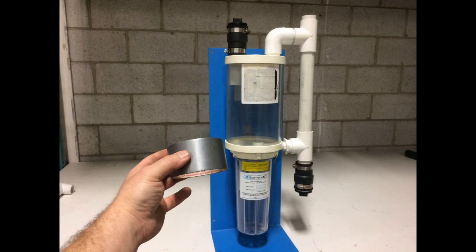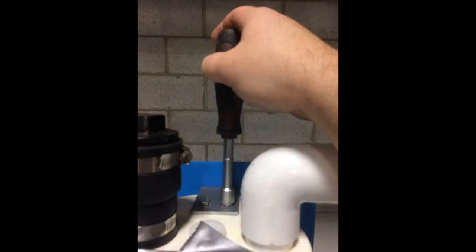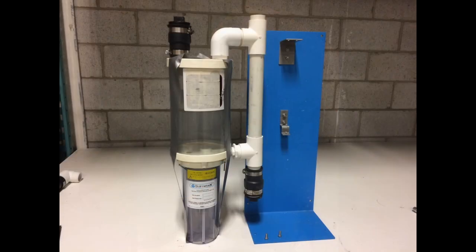If you are upgrading from a filter type amalgam separator, bring out your duct tape to secure the filter to the upper chamber. Use your 7/16th nut driver to remove your amalgam separator from the mounting plate.